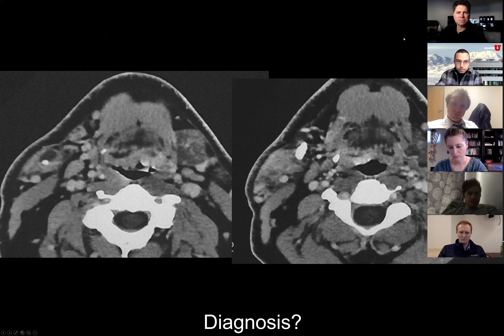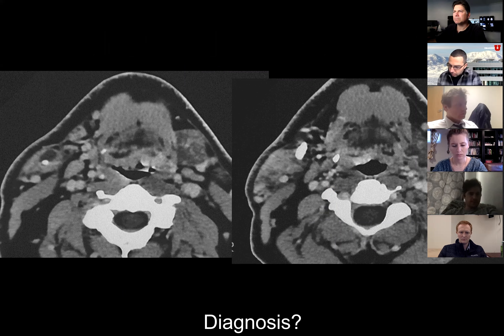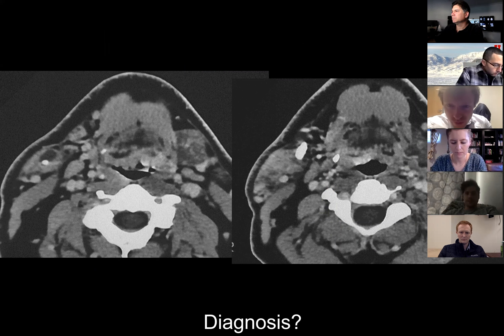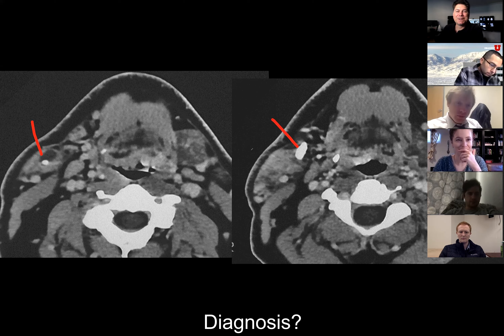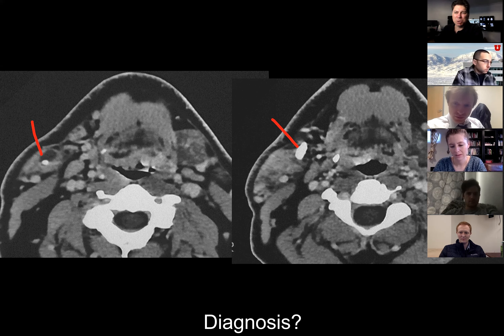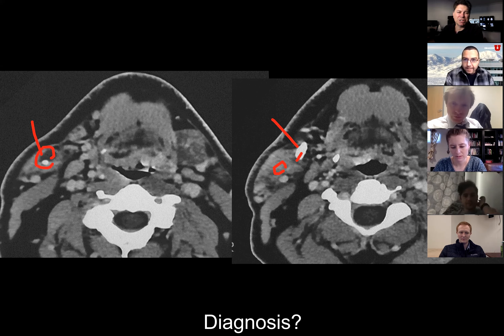CT neck with contrast. Is it the right submandibular gland with a sialith and ductal dilation? Yes. We have high density on that side. On the ABR they love to talk about submandibular duct stones — about 65% are within the gland itself or within the proximal duct. You may get intraductal dilatation of those lesions. They can be seen anywhere along that course — in the sublingual space when we think about the oral cavity.